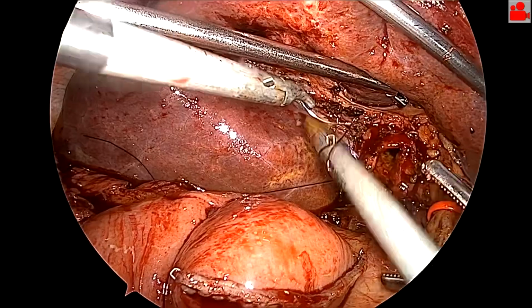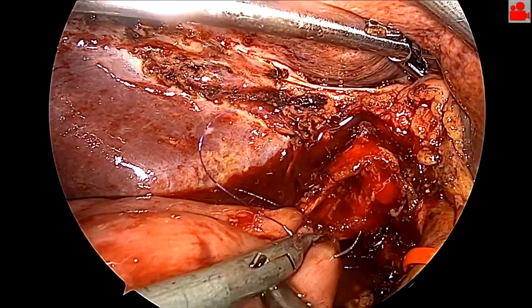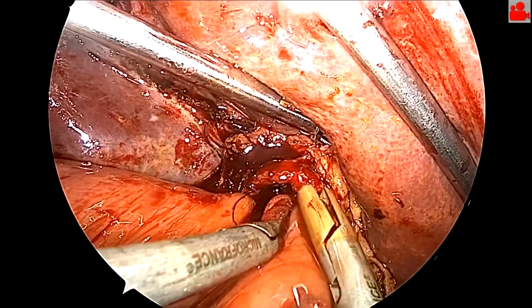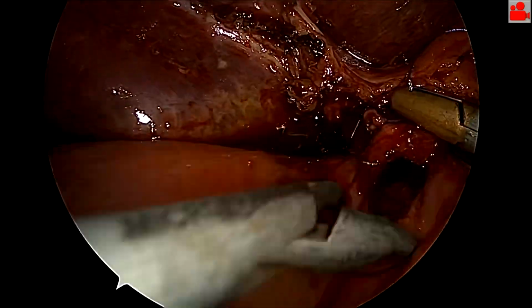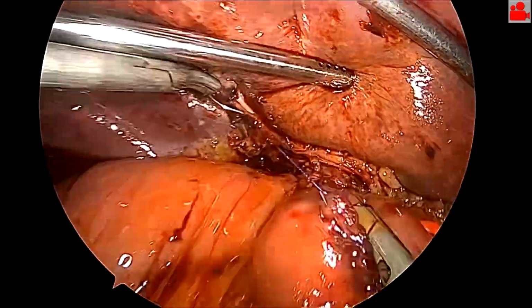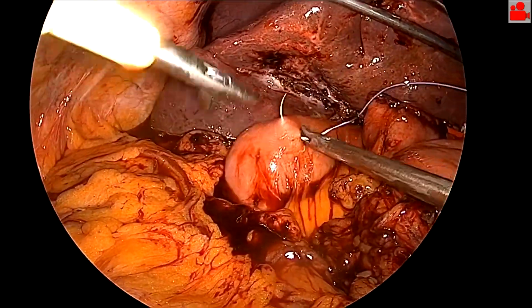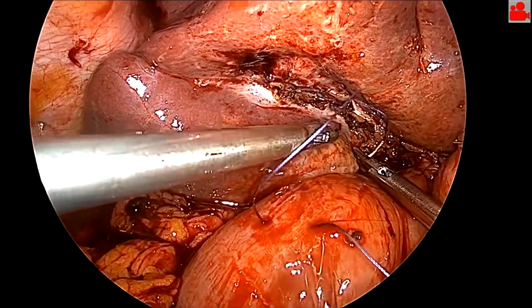In view of the fact that the bile duct was significantly dilated, we decided to perform an end-to-side anastomosis using absorbable monofilament sutures, starting from the posterior aspect, heading from 9 o'clock towards 3 o'clock, with adding a suture through the liver to release traction from the anastomosis area.